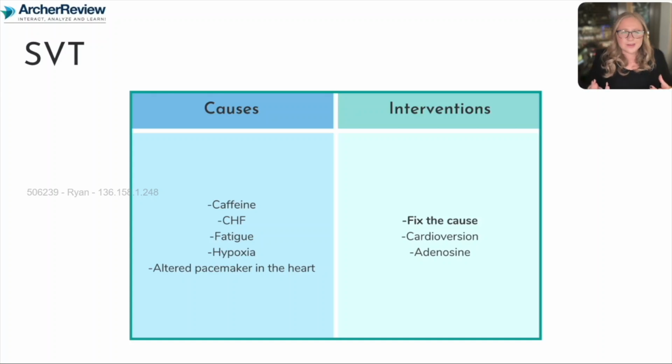I also need, if I'm a nice nurse, to give my patient and their family some heads up about what's about to happen. If your client's awake, they're going to feel like they got kicked in the chest. Their heart is stopping. Let them know, like, I'm so sorry. This is going to hurt. This is what this is going to feel like. We expect this so that they don't freak out.